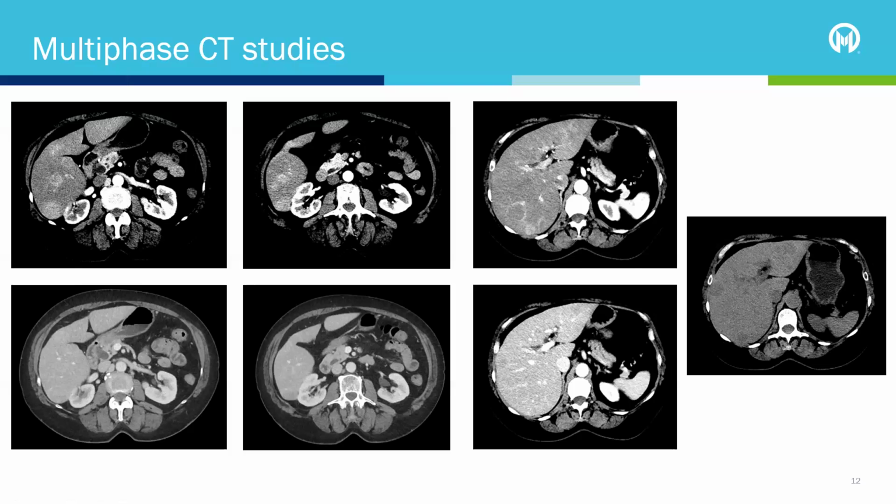And that's probably one of the problems we run into with neuroendocrine tumor imaging, is that when patients get imaged at places that aren't cancer centers or don't deal with neuroendocrine tumors a lot, they just do the portal venous, they just do standard imaging. And it's a problem, right? Because you can see there's lesions all over the place, liver tumors all over the place that we're not seeing. In the worst case scenario, you could look at it and think there's no evidence of metastatic disease in the liver, when in fact there's many lesions, many metastases. So that's why it's important to do more.